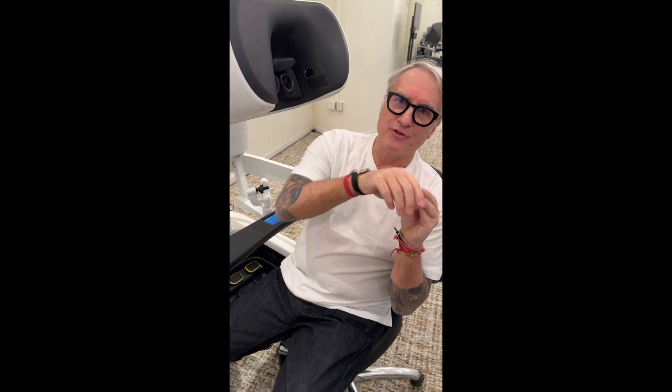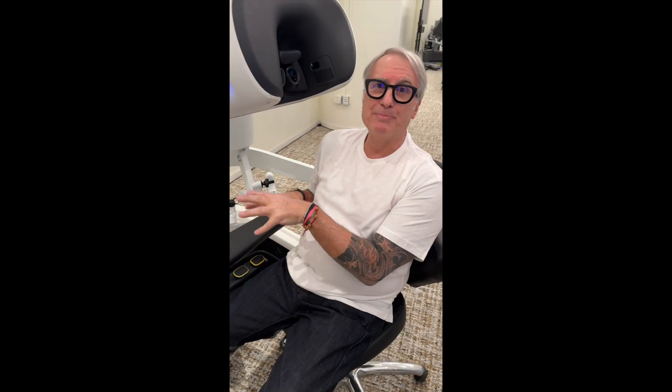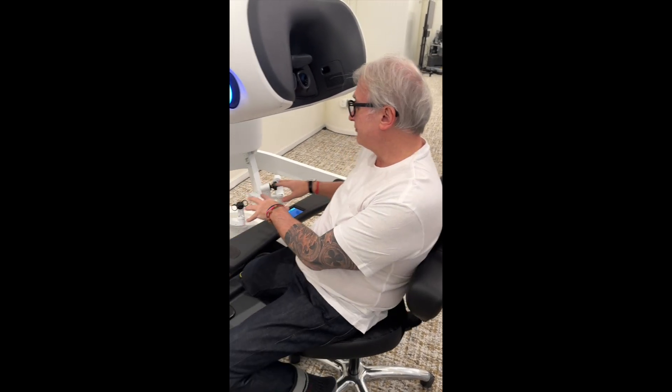These are just a few of the things, but I wanted to show you — this is geared towards my colleague physicians, but also patients — the advantage of this type of device. This is not just a technical tool, it's also an AI tool, a robot, a computer that collects data. And at this point, we can bring it to the next level, and nobody can complain about robots anymore.